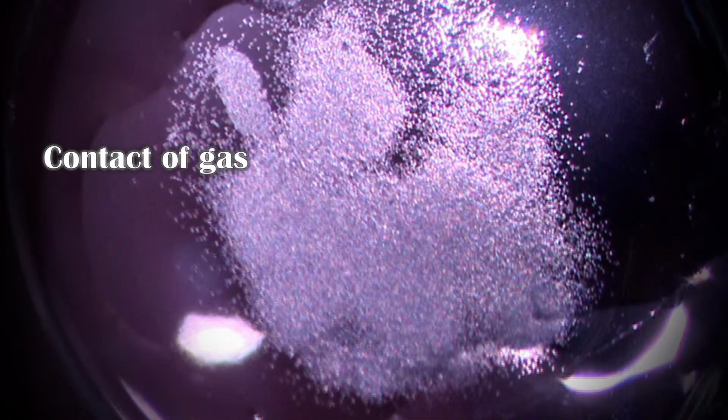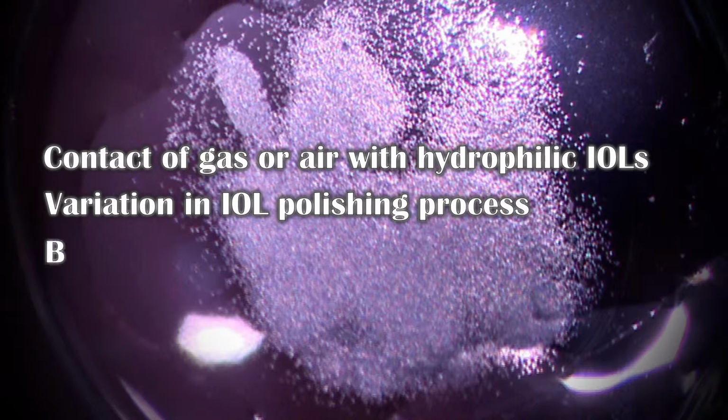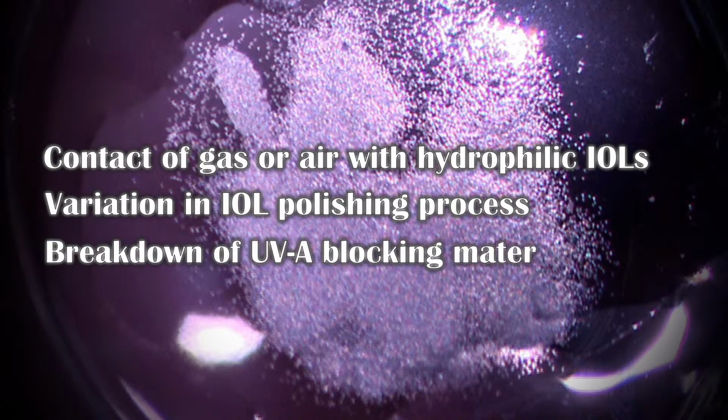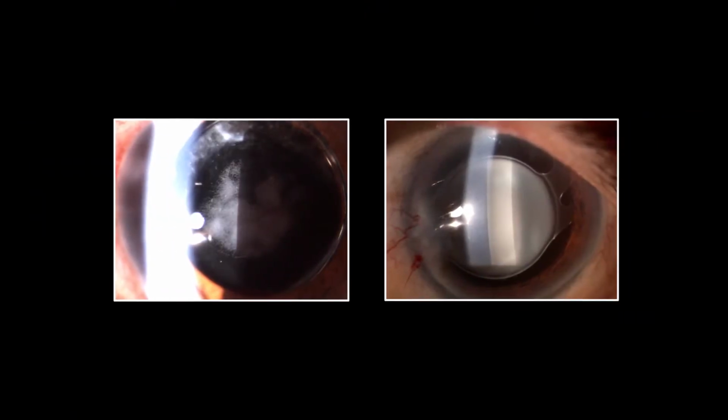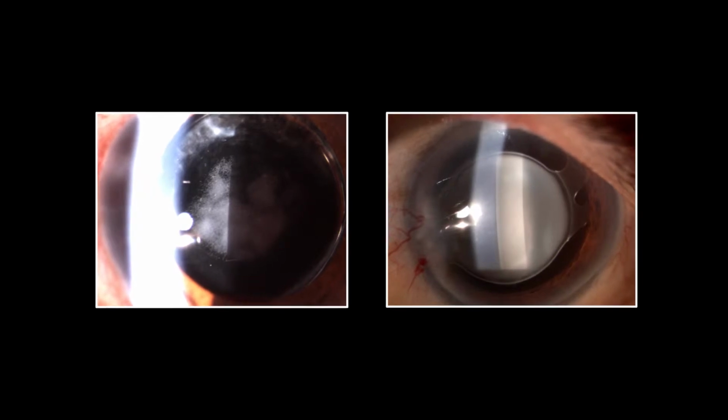Causes of opacification are contact of gas or air with hydrophilic IOL, variation in IOL polishing process, or breakdown of UVA blocking material. This video illustrates two cases of opaque IOL managed in different ways.